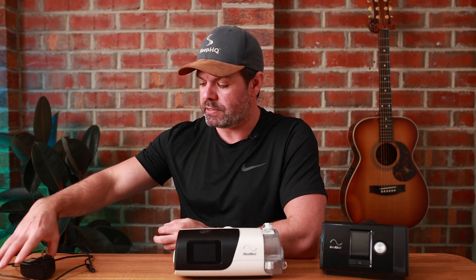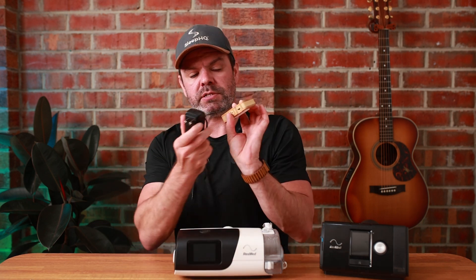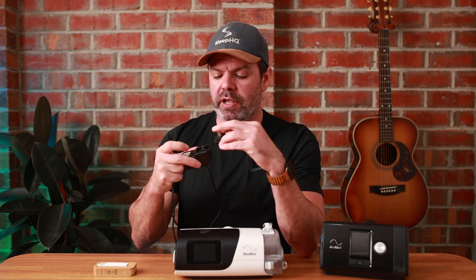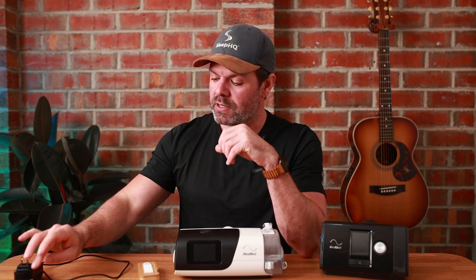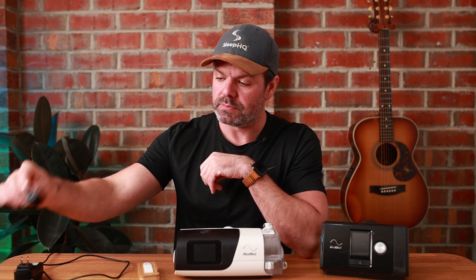The last piece of the puzzle is your power supply for your MU — it just plugs in the side here. We send you a bunch of different connectors, just in case you're going on holiday or coming to Australia. You've got US, Aussie, British, and European.